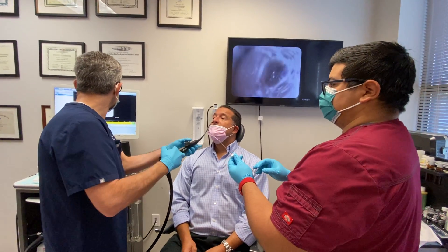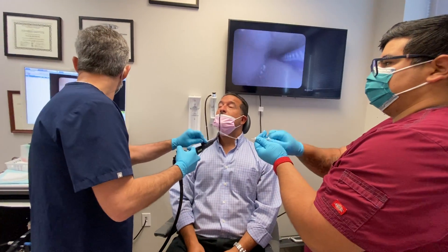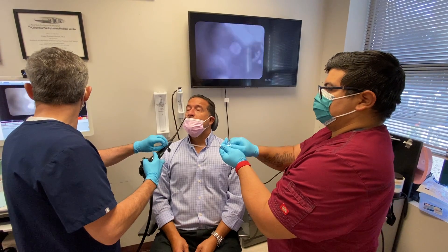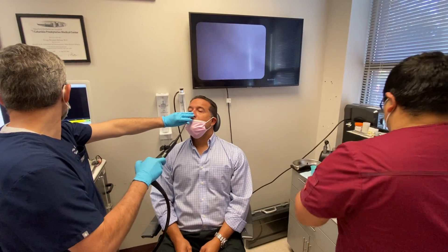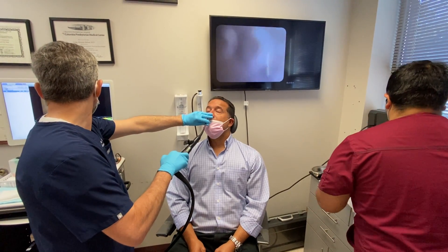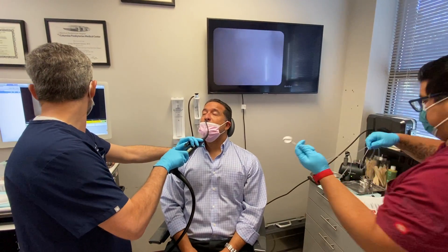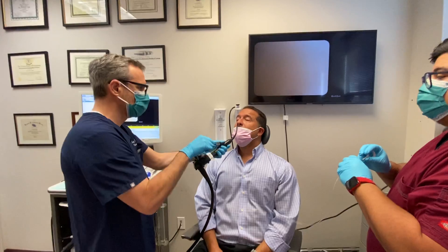Good. And this will give us a sampling of what's going on down there. And now take the second one. It's going to be about 20 more seconds if that. You're doing really great.